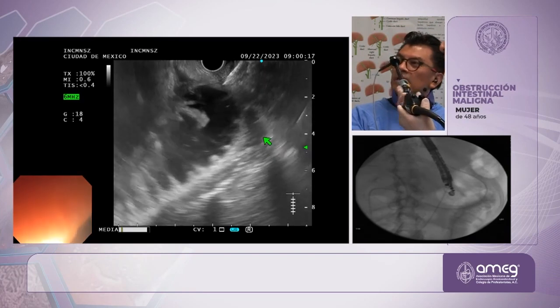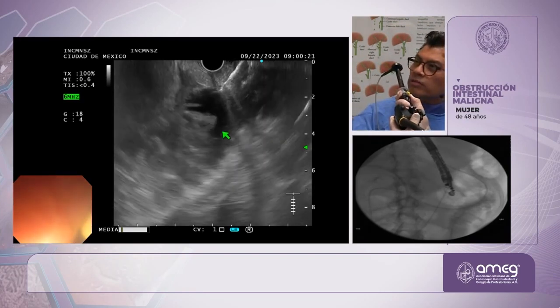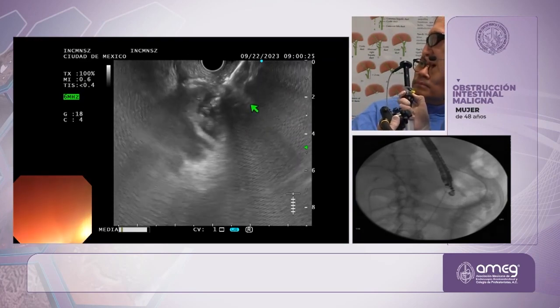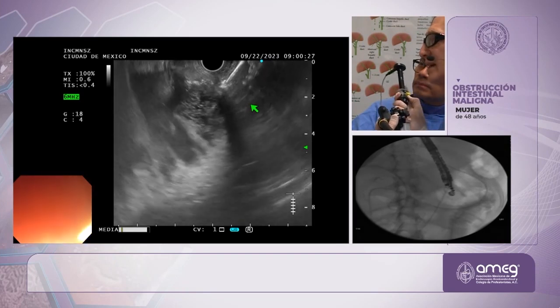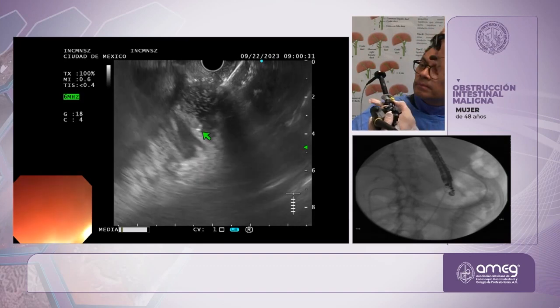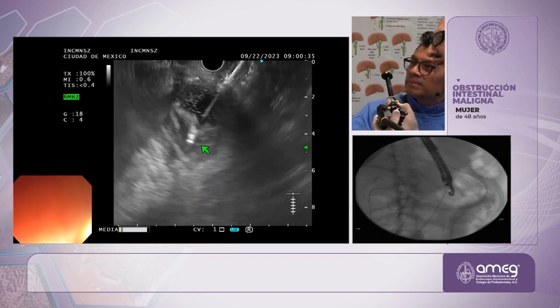Well, this looks pretty good. Ya. Esta asa es mejor en eje longitudinal, como lo ven ustedes. Let's go in and do this one then. Okay, you saw the bubbles, right? Okay, I'm inside. You can see I'm pushing forward. As soon as the bubbles, you take off the cable. Okay, good. I'm pushing in as far as I can.